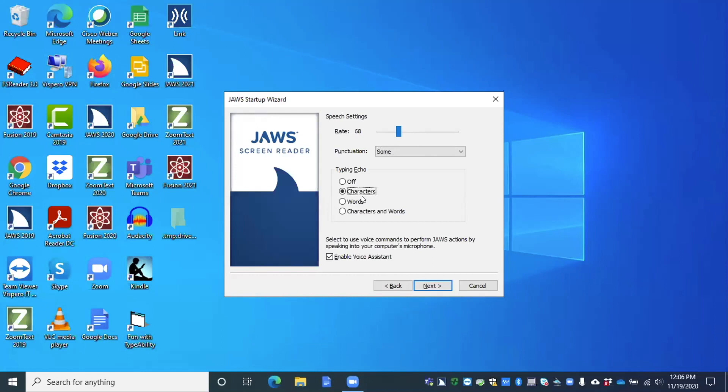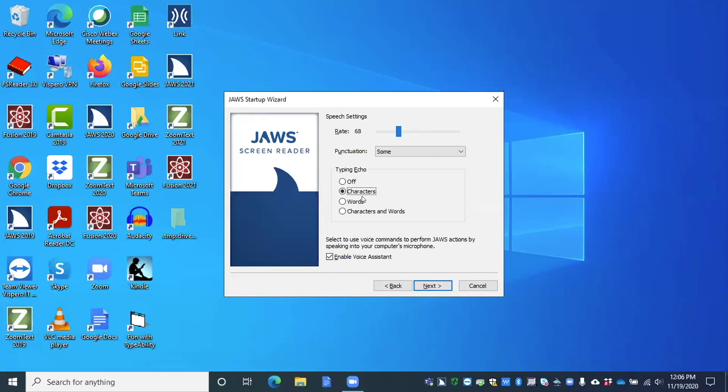Typing echo characters radio button checked. Now you heard it say radio button checked. So typing echo is what happens when you type, let's say you're in Microsoft Word, for example, and you type, are you going to hear the characters, words, both characters and words, or none. So with the radio button, you can just use your up and down arrow keys once again to change that setting. If you have a check box, you're going to use your space bar. So here in the startup wizard, we won't go through all these settings, but you can just keep going through these screens by tabbing to the next button, pressing the space bar, and then eventually you get to the last screen and there's a finish button and you can just press enter or space on the finish button to close the startup wizard.